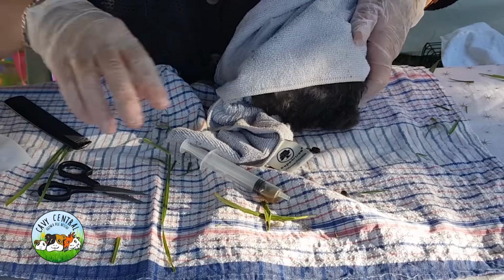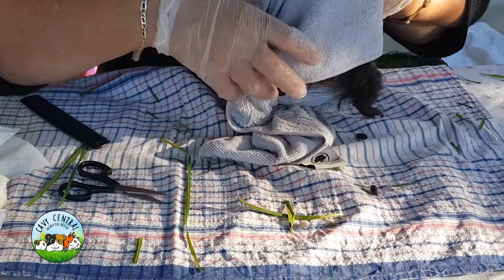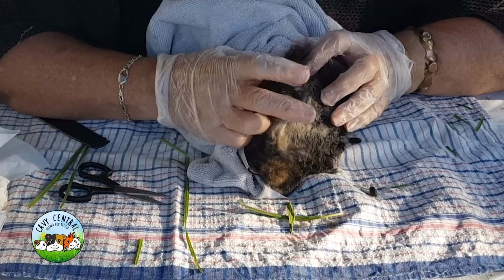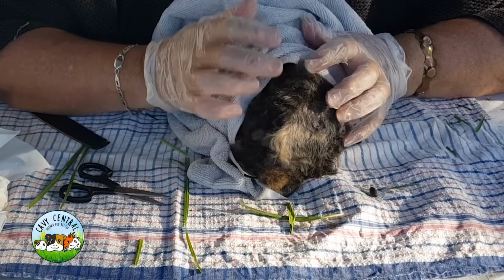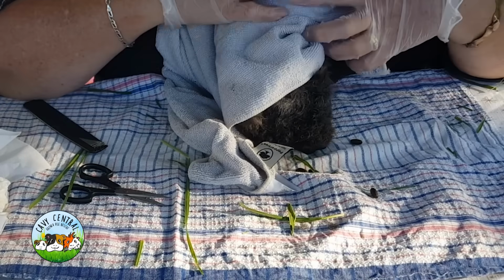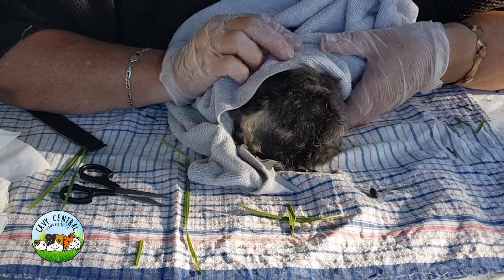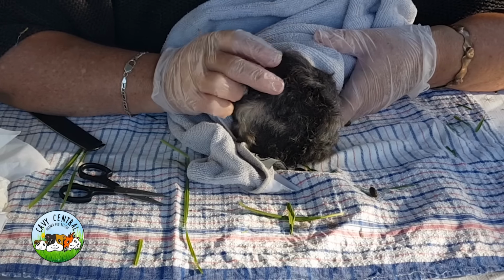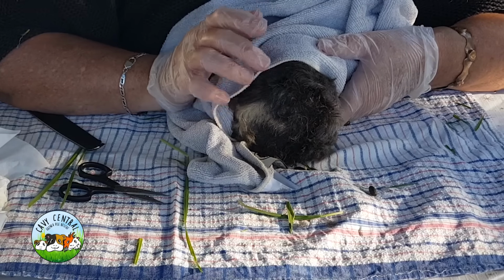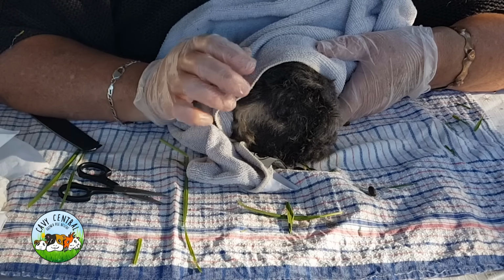Okay, so when we see a sebaceous cyst like this, because we have not lanced it and it has just the one little entry point, it's more likely that it will get some pus reappear in the next few weeks. Hopefully we've done a good enough job that that won't happen. If we have, it just means in a week's time we re-flush and rinse that. It will not be anything remotely like what it was. That just won't happen again. And the sort of pus that will come out will be bright yellow and runny.